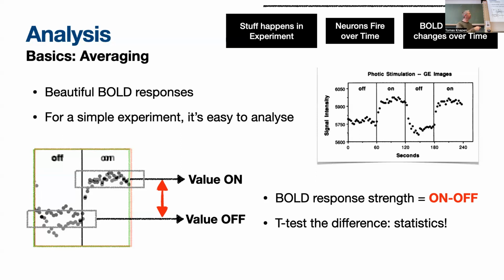So you have a very slow experiment, right? And you already see that here you have this little overlap between the off response and the on response, right? So what you're doing is you're epoching the data. And what that means is that because of the slowness of the bold response, and I'll get into this in detail in a bit, it's very hard to make sure that you have an epoch that doesn't have any contamination from a previous event, right? And what this means is we are forced to do extremely slow experiments, right?